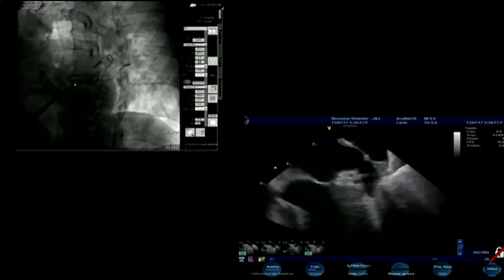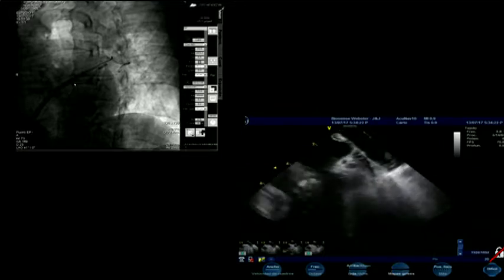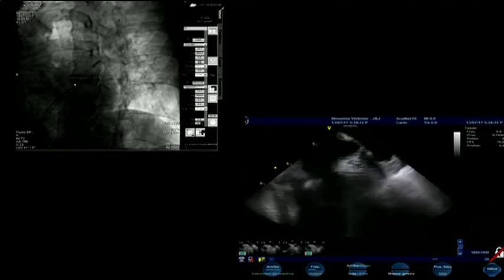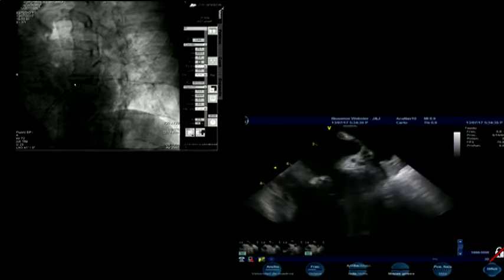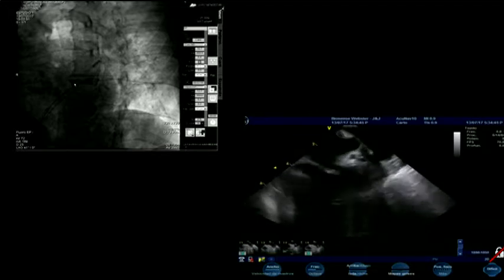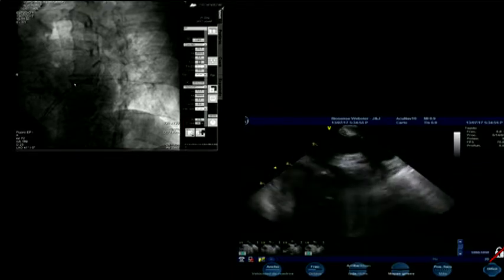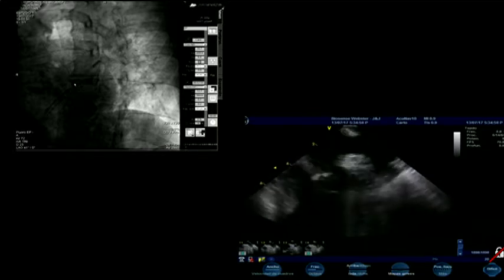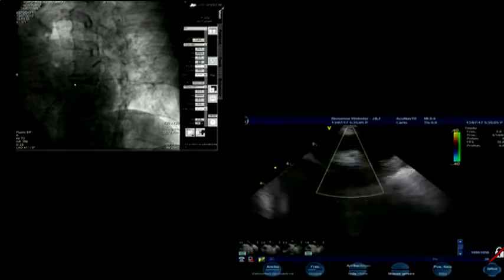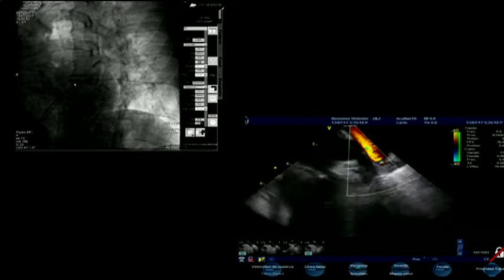The measurement is 1.7, so I am going to re-advance the 14 French sheath. Here we are — and now the pigtail. The wire is contaminated so we will take it off and pass the pigtail now. All these echo measurements have to be confirmed with angiography. This is a combined procedure of echo and angiography — they are very interdependent.